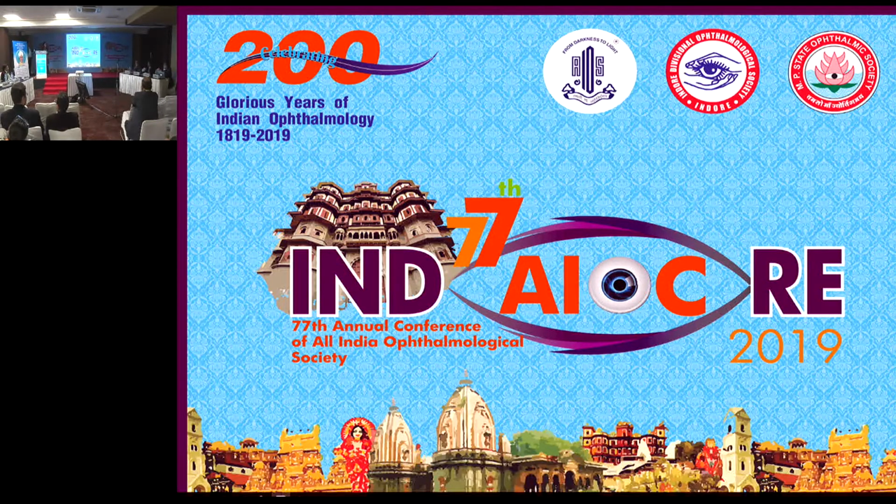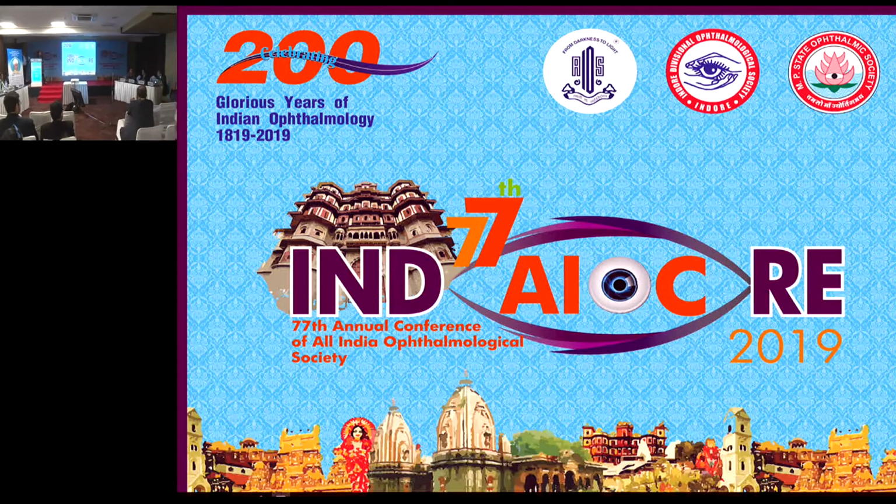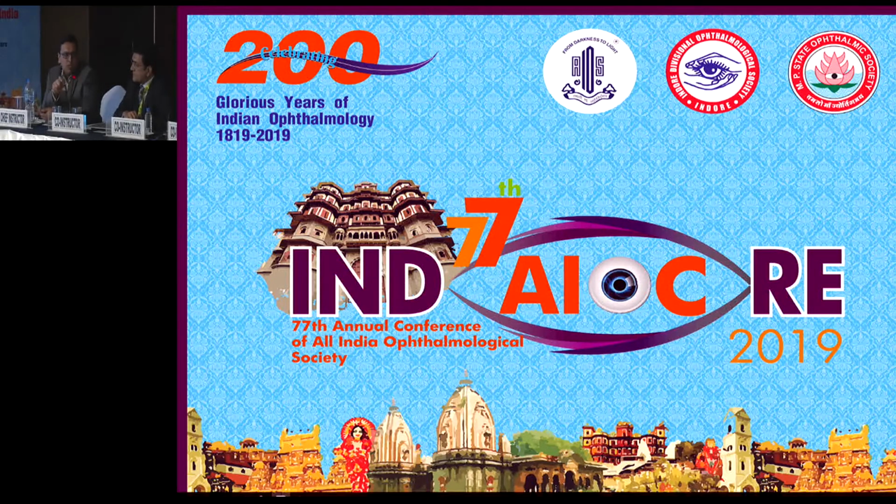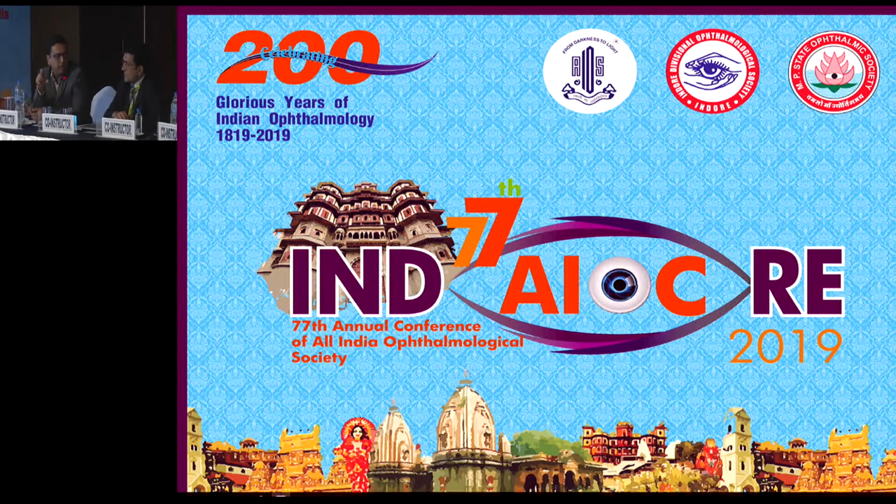I've just got one comment here. OCT is an evolving technology. We still don't know; there are a lot of artifacts in it as well. So we need to be very careful when we define ischemia, because a lot of this could be fluid as well. I think we are learning, the softwares are getting better, but it is not at the stage where we can replace the fluorescein angiogram with OCTA. There will be situations where you will need that. So what about your comments? What do you feel?